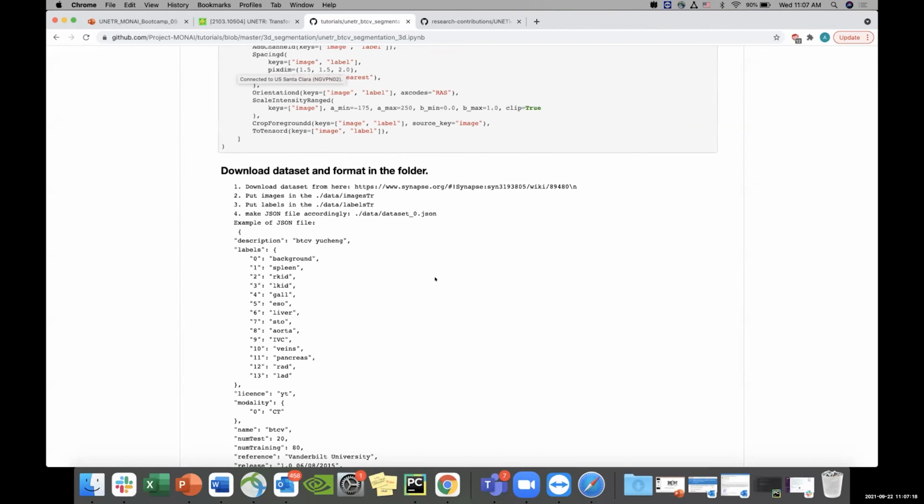And if you're talking about the 2D applications, you should also be able to utilize the original ViT model weights. So those are some pre-trained weights. So then the transfer learning makes sense in that respect. But bear in mind that going from natural images to your application of interest, there is some sort of a domain gap. But our experiments show that for 2D applications, at least, starting from a pre-trained checkpoint always helps to get better results by at least 3 to 5%. We tried that for some applications in 2D, but have not published those models.